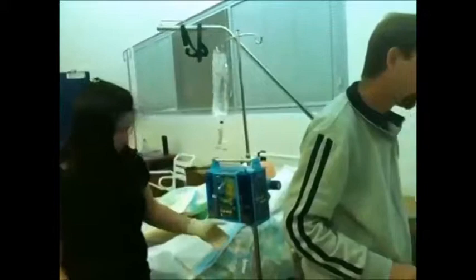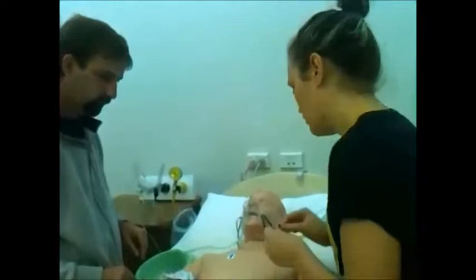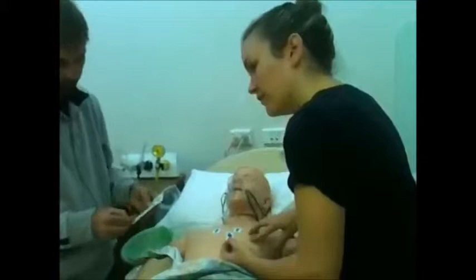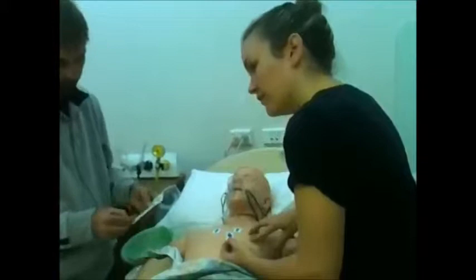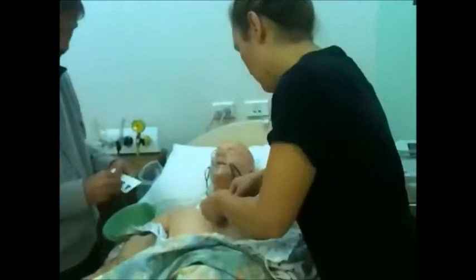Fourth intercostal space. How do you get that up? That's correct. Number two — sternal border, fourth intercostal space. Evan, I'm just going to do this — be careful with this. I'm just doing the alcohol swab. And we're waiting for 30 seconds. It's ready — 30 seconds. Excellent, thank you. So it's been 30 seconds now. I'm just going to keep holding this.